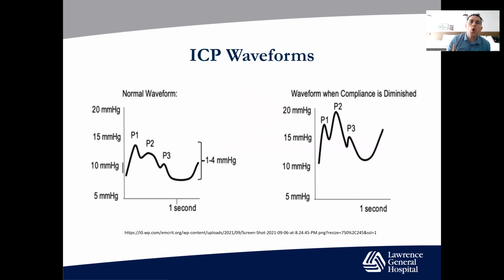So when we put an EVD in, this is the waveform that we're going to get. I'm going to go over it briefly here and then in detail on the next slide. The normal waveform that we want to see is here with a P1, P2, and a P3.